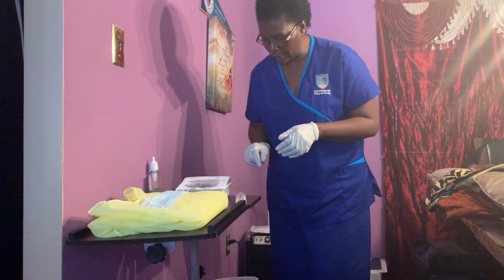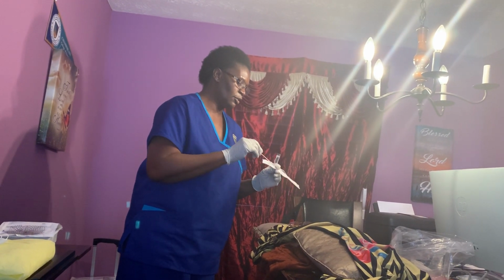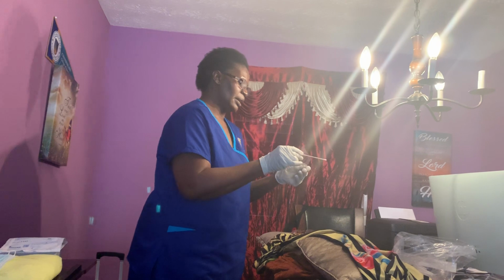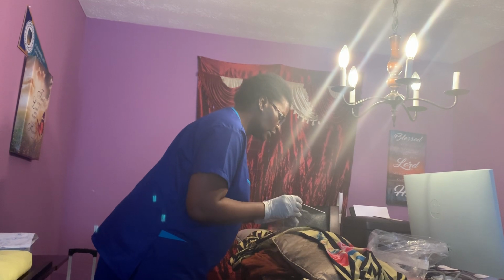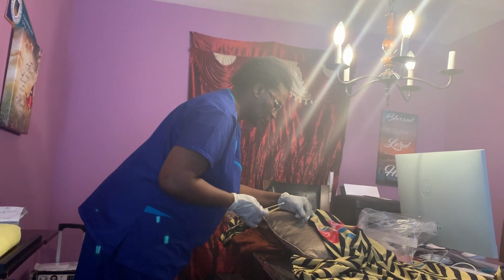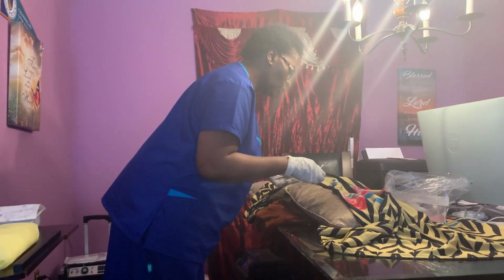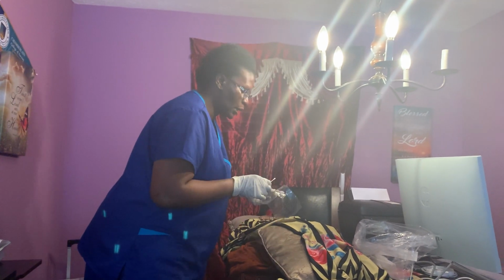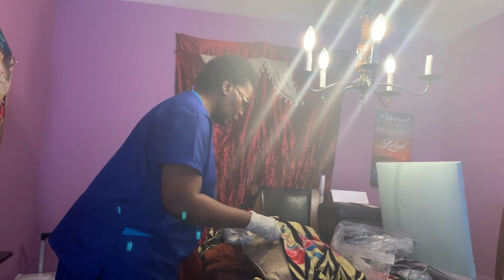So here is my Q-tip. I'm gonna take my Q-tip out to use for tunneling, and then I'm gonna trash that. And then of course I've already prepared my measuring tape, so I'm gonna measure the wound. So here I go using the centimeter wound measurement. So we go here, I measure the length, okay, and then I measure the breadth. If I could not get it very well, I'm gonna use this Q-tip to measure the wound. Alright, 4 centimeters is the length, and then the breadth.